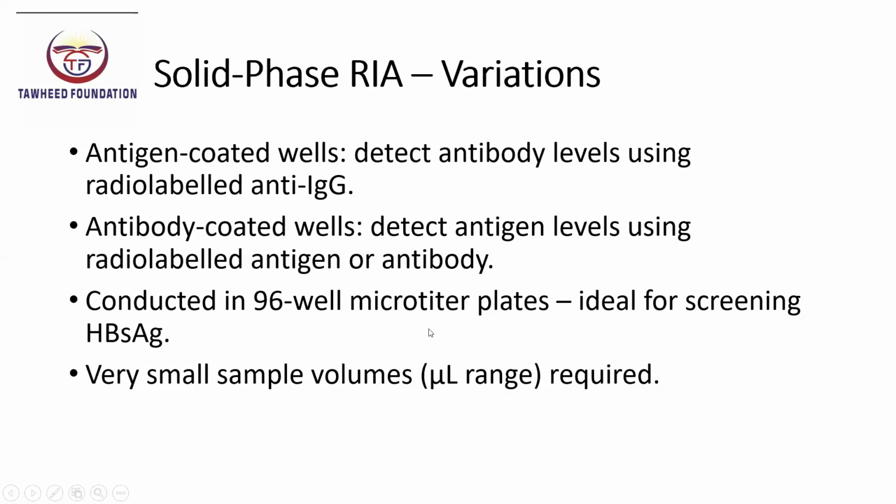One notable application of the antibody coated solid phase RIA is in screening for hepatitis B surface antigen, that is HBsAg, where even microliter quantities of serum are sufficient for testing. So, very small sample volumes in the microliter range are required for this solid phase RIA.